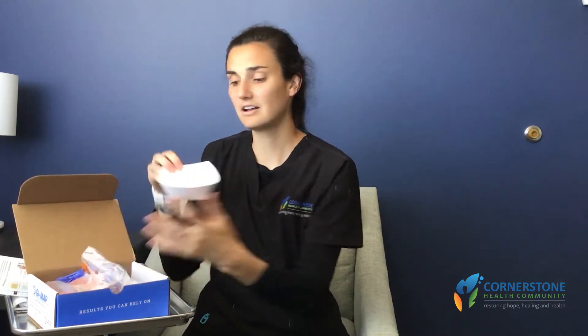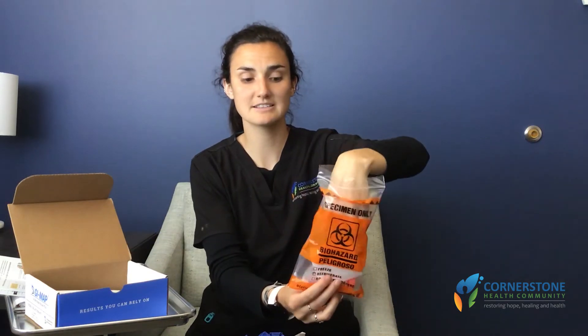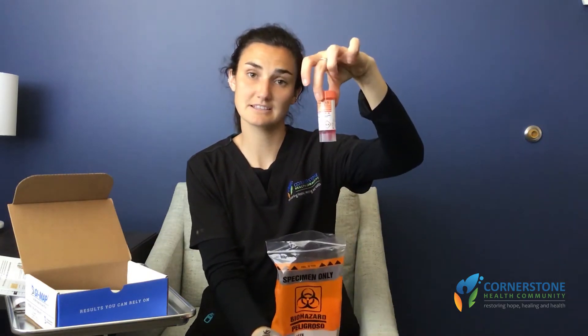Next we have our little french fry carton that you'll be taking to the restroom with you, as well as a pair of gloves, and then we have our biohazard baggie which has this vial inside of it.